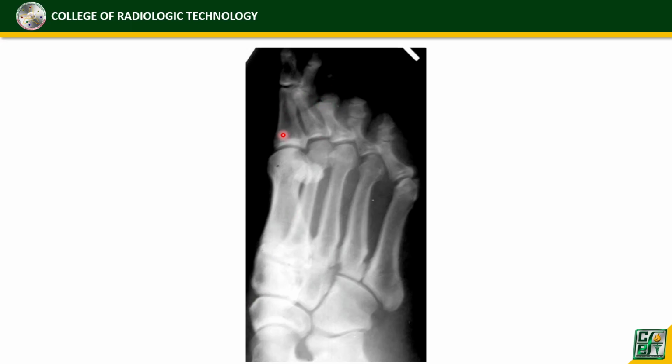So, dito, kailangan natin dito maganda yung kanyang recorded detail and definition and wala kang unsharpness. Dapat, okay? So, ito ay x-ray ng foot. So, ang ginagamit dito ay small focal spot. Tabletop, ilang inches ang SID ng tabletop? 42. Okay. Pag tabletop, 40 inches. Okay.